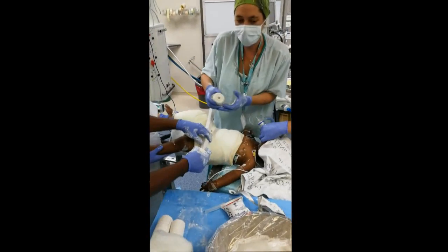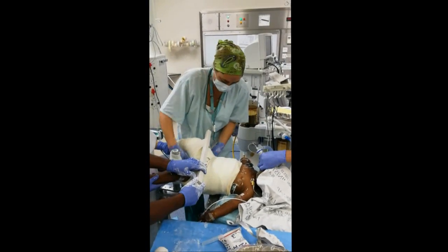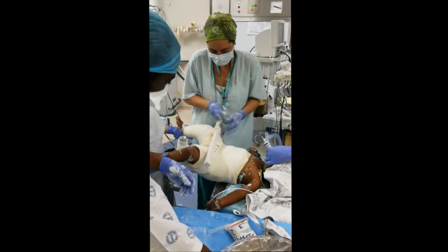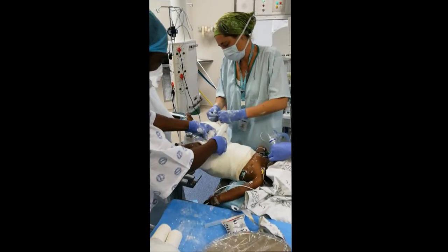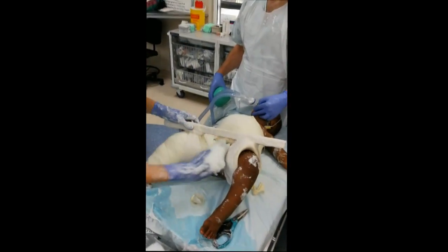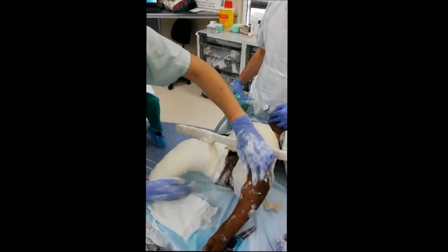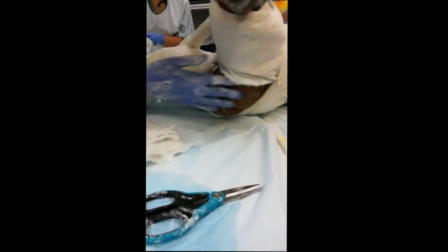Apply the final stabilizing layer to hold it in abduction so that it doesn't break. Now you're finished. You can remove the lunchbox, and as you can see there's quite a lot of space for the chest to expand. There's almost enough space for a fist to go in there. Look at the back — see that there are no hard edges. I've trimmed it a little bit there for a nice smooth edge. That should do the trick.